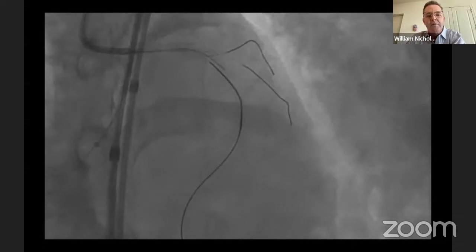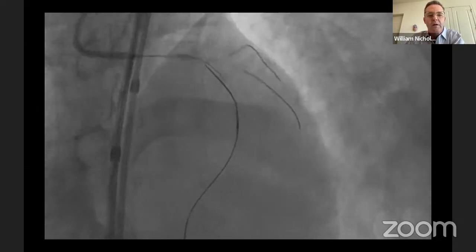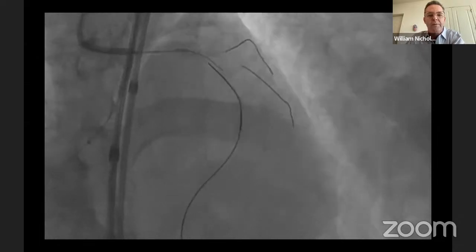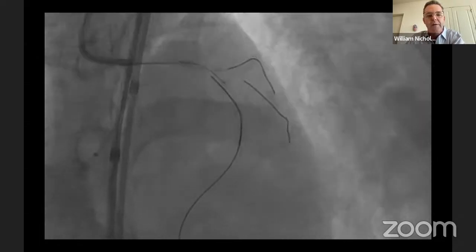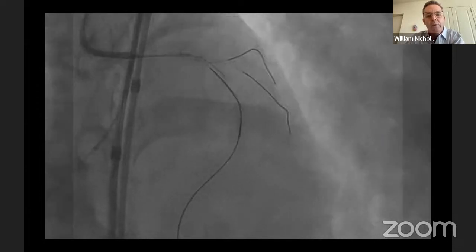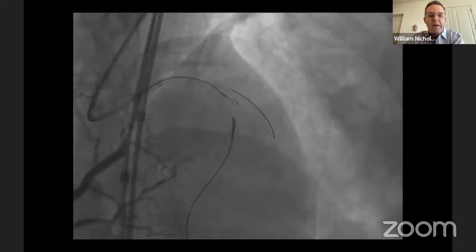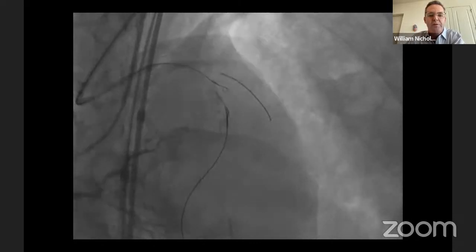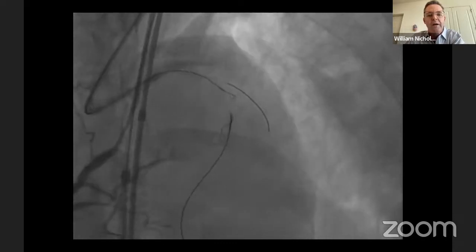The other option we thought too was that our antegrade wire maybe started subintimal and wasn't in the true lumen from the beginning. We thought maybe going back and IVUSing that to try to repuncture the proximal cap in the true lumen would be a good strategy as well. We thought at this point that maybe we would take an antegrade knuckle and push it a little bit and see whether it wanted to define itself and set up.